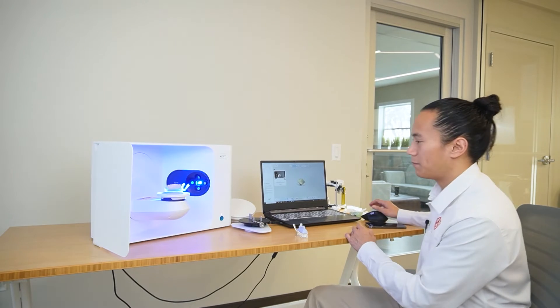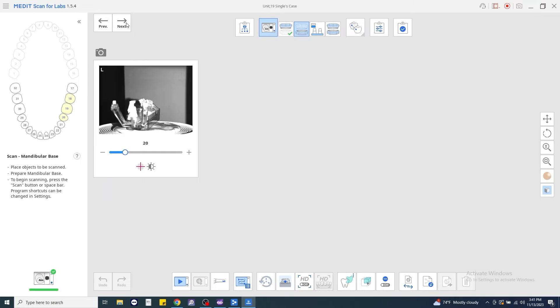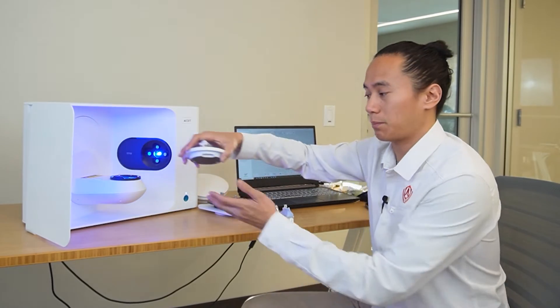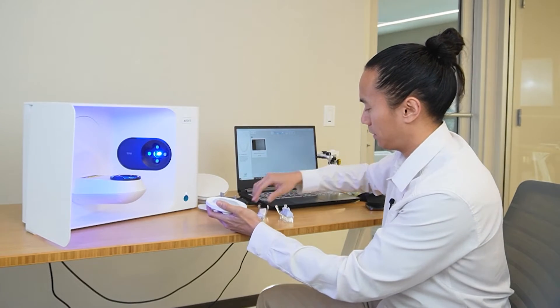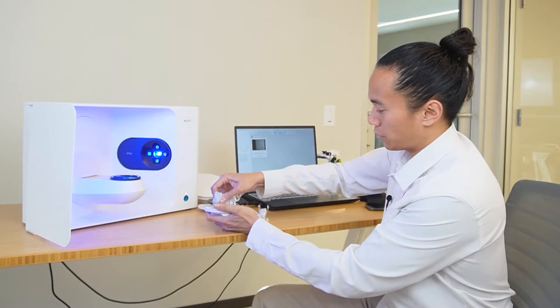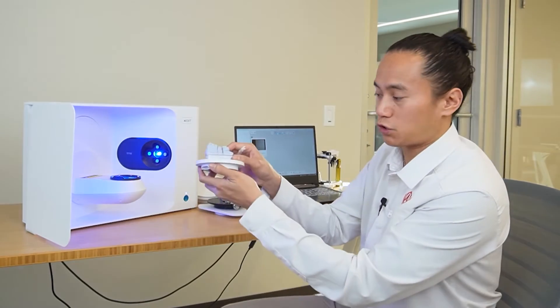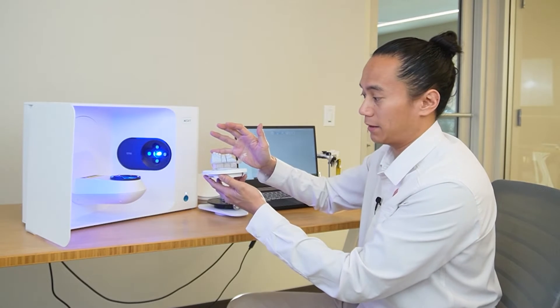All right, this looks good. We'll go ahead and we'll click Next. Again, take your plate off of the scanning arm. Take the model off. Then we'll go ahead and we'll place our base model here. For this specific strategy, I'm leaving all the dies in place for the base scan.